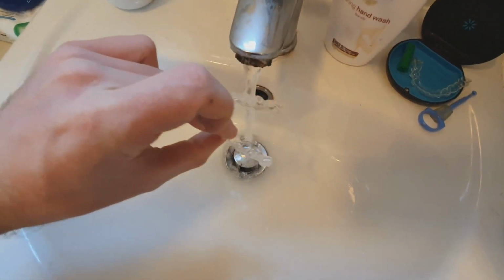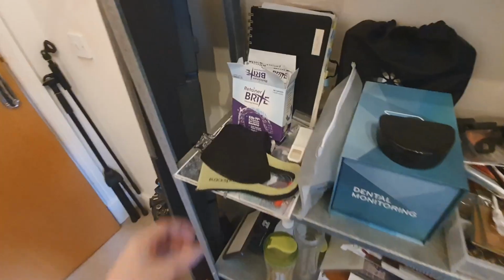So I make my breakfast. I've got the bowl of hot water. Only once I've got my breakfast ready and I can sit down and eat it, that is when I go to the bathroom and take out the aligners. I whip those out, give them a quick rinse, and then I will keep them with me because in the next 5 or 10 minutes I'm going to be putting them into that hot water, or warm water should I say. Once I've taken the aligners out, I will tap my phone to tell the Chayminder app that I'm no longer wearing the aligners. So yeah, eat my breakfast, drop the aligners in the Retainer Brite.